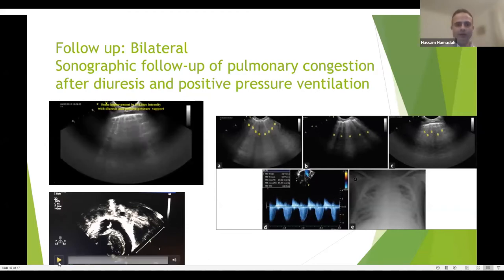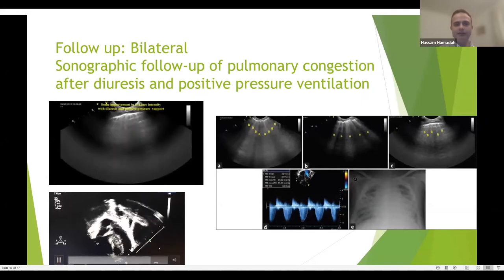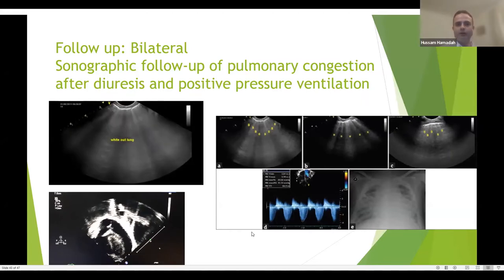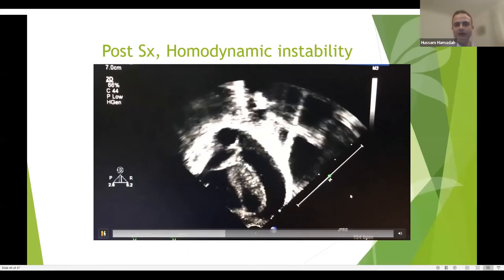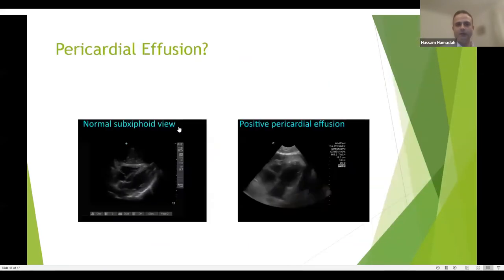When we did echo for him also, a quick screening, we found very clearly that the patient also had pericardial effusion. We are using ultrasound for following the response to our treatment and our decisions. So here also the pericardial effusion for the previous patient is very, very clear. And you can see also the lung is congested from this video.